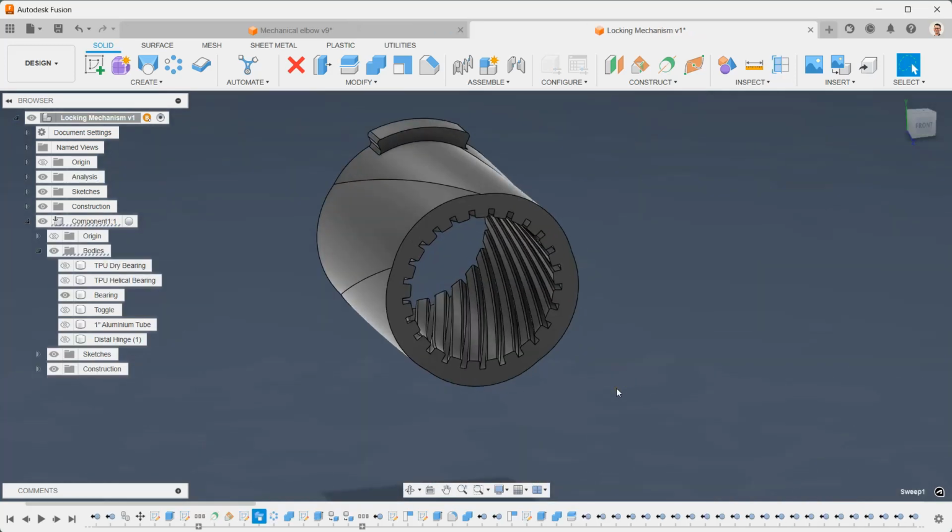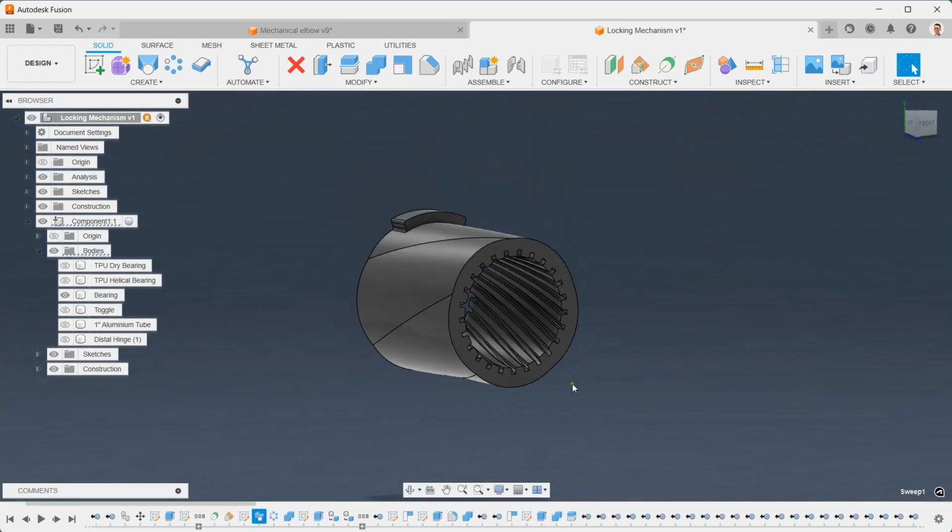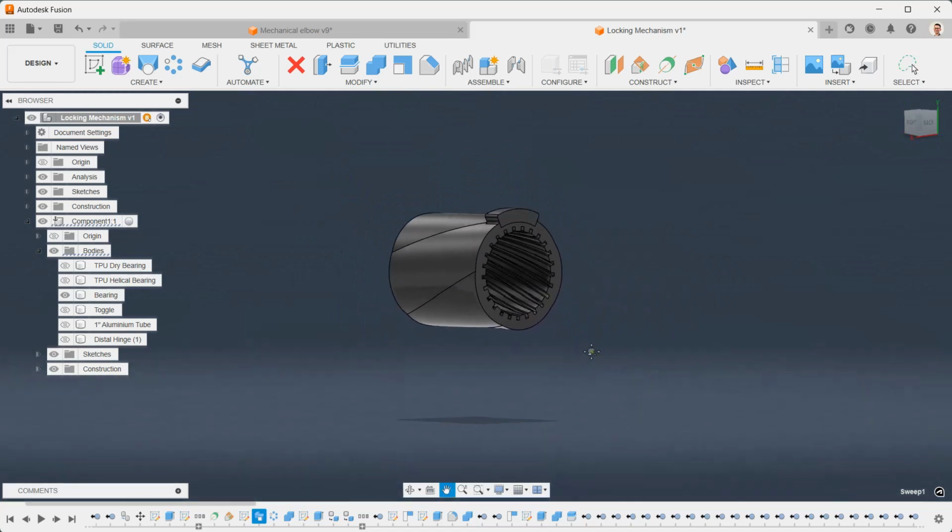The other option was to have no splines at all and just rely on a slide fit, and then any interference from the cam is just going to push down where it pushes down and not have to worry about the teeth so much, or the splines, sorry. So there we are, that's day 3 updates.